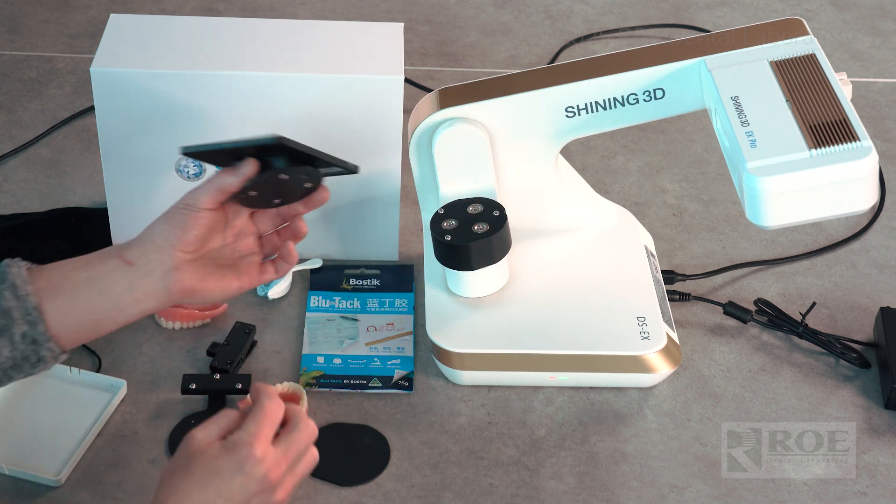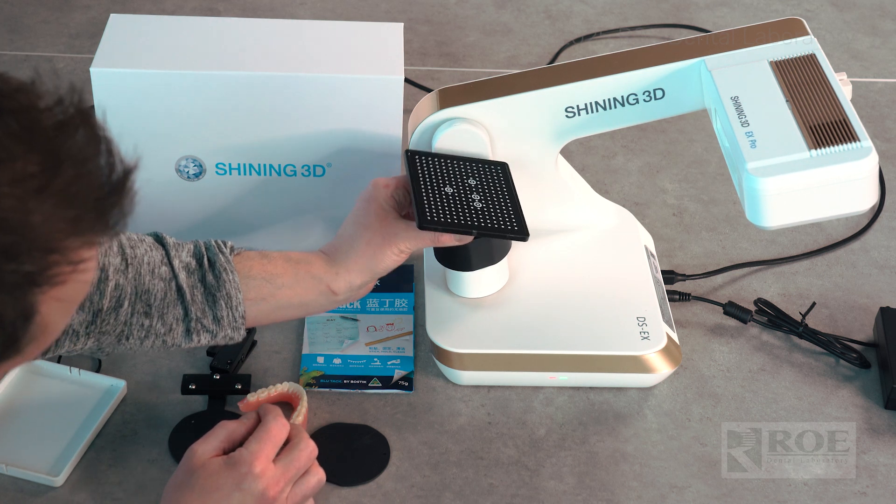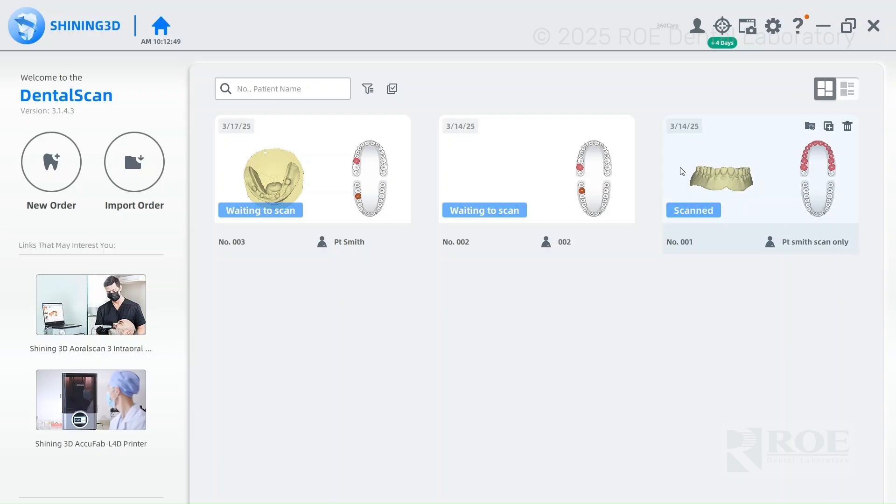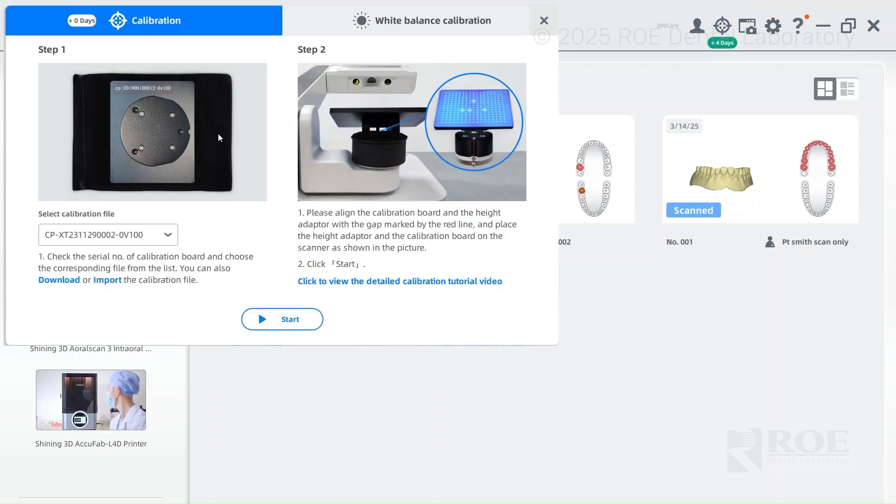This plate also has a little notch — you line it up like so. On your screen you'll see a little bullseye icon that says 'plus four days,' meaning it's been four days since the last calibration. Since we moved the scanner four days ago, we have to recalibrate. Left-click on that, and you'll see there are two different calibrations — the white balance calibration, which we'll do after.